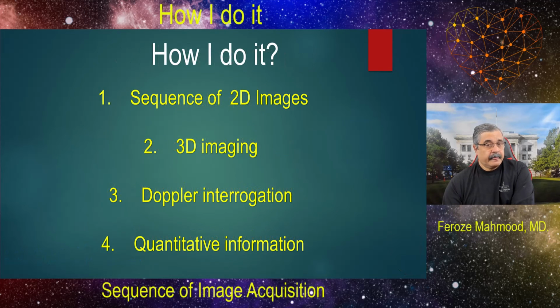Now, how I do it involves a sequence of 2D images, 3D imaging, Doppler interrogation, both pulse wave, continuous wave, as well as color flow Doppler information, and lastly, quantitative information as far as structure and function is concerned.